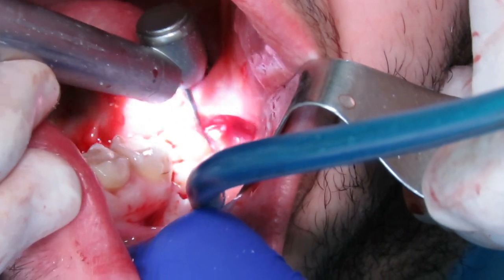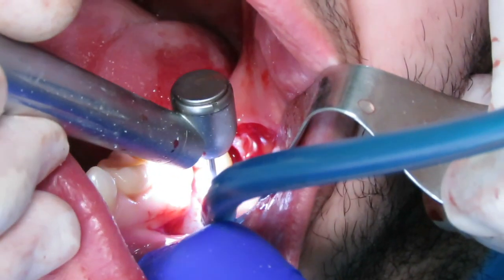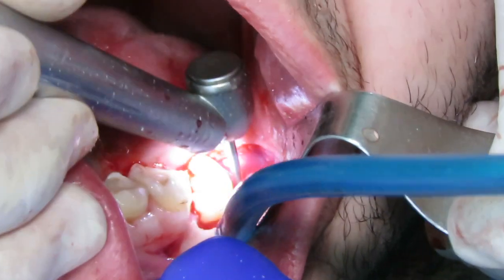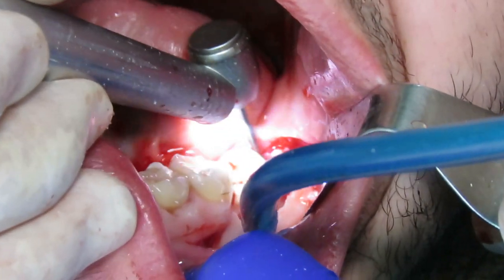We start exposing the wisdom tooth using Fisher burr. We can use a round burr and then we use a Fisher burr. Round burr in this particular case.